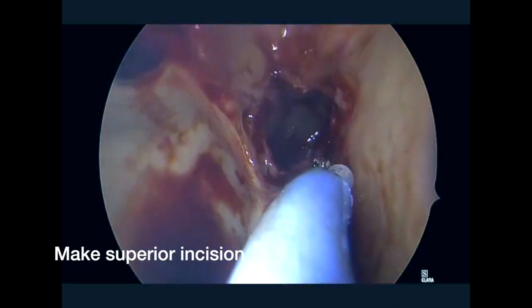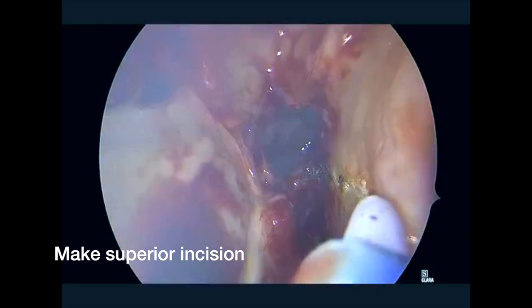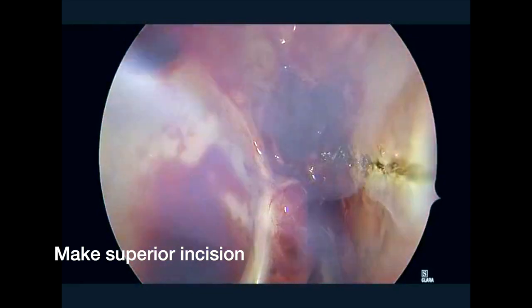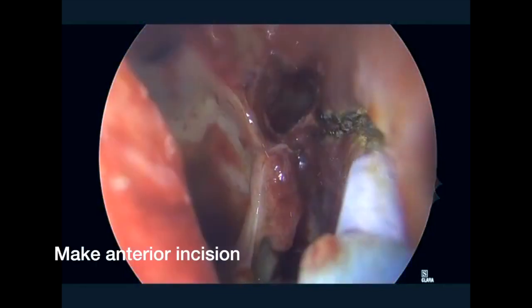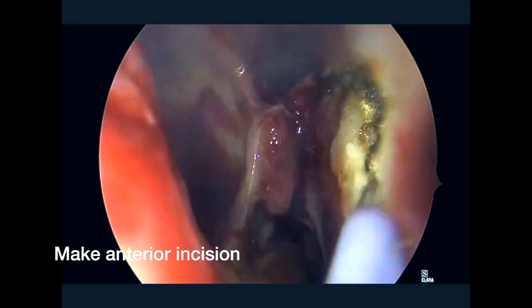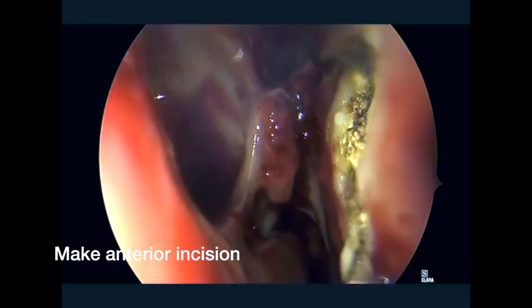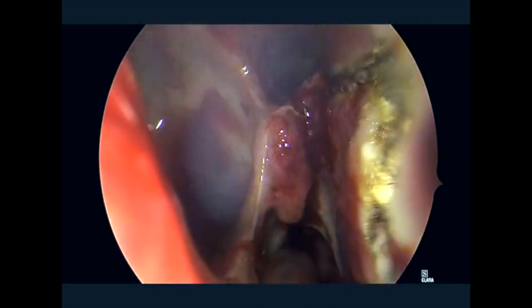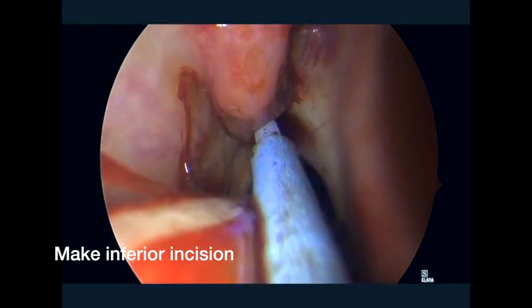Here's a superior incision. We essentially bring that straight anterior from the sphenoid opening, approximately one to one-and-a-half centimeters. Her middle turbinate had been resected in a previous surgery, so that landmark is not available, but generally to the anterior edge of the middle turbinate should be sufficient. That incision is then taken at a 90-degree angle inferiorly.